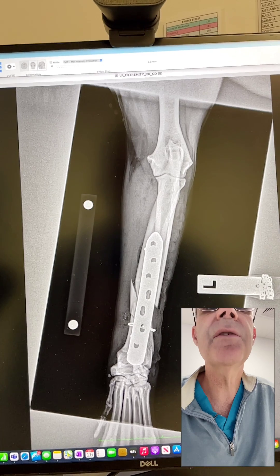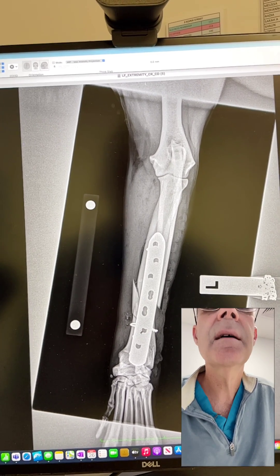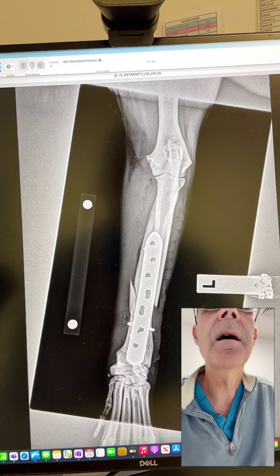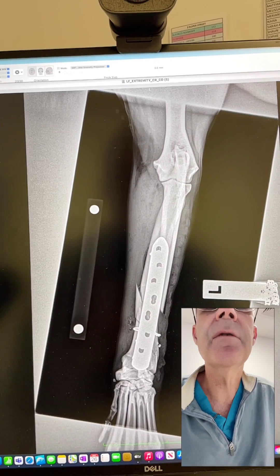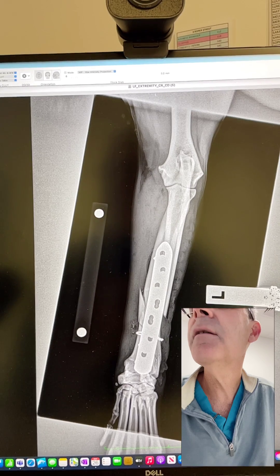So everything is going to be very stable, no screws close to the joint, but I haven't gotten perfect alignment of all of my fracture fragments, which is fine.